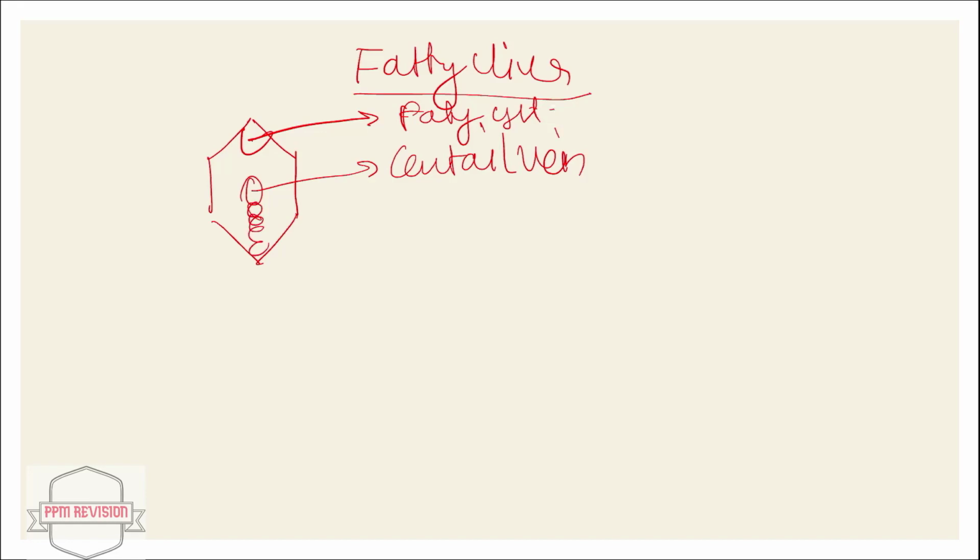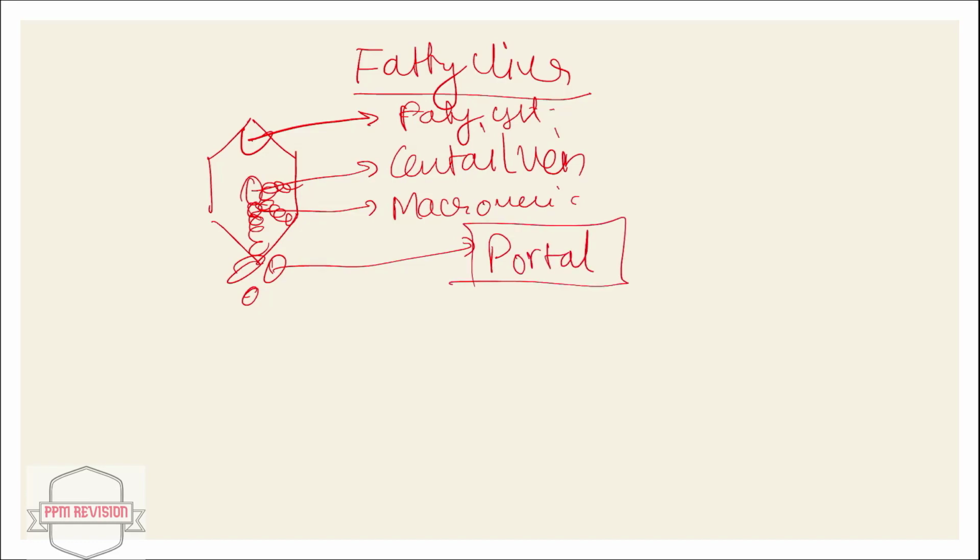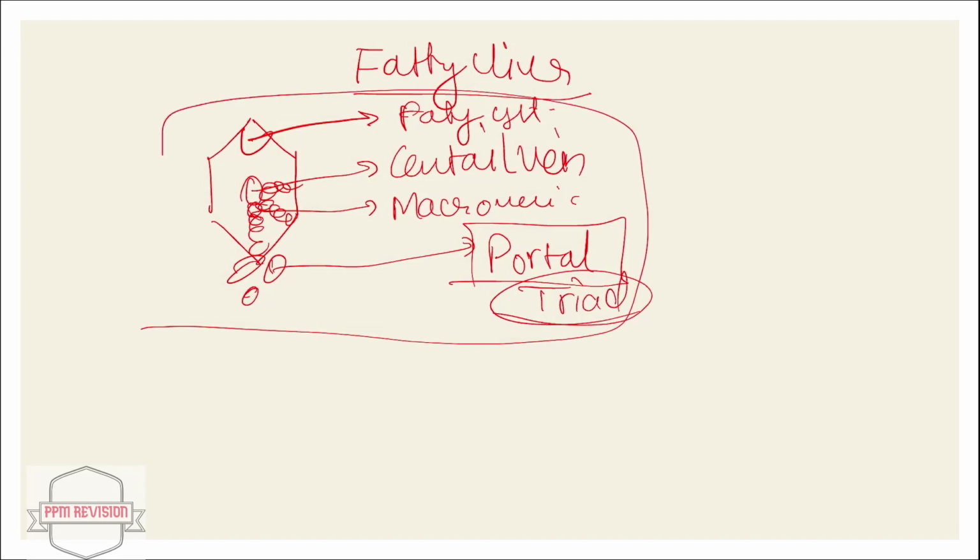There's presence of the macrovesicle. And as usual, the presence of the portal triad. I'm assuming everyone knows what a portal triad is, so I'm not explaining it. Then moving ahead, let's look at some of the points.